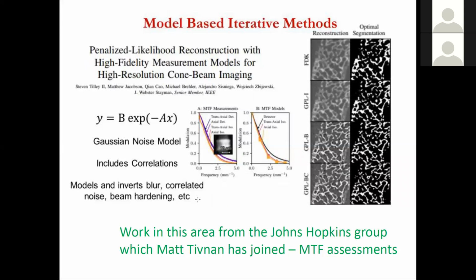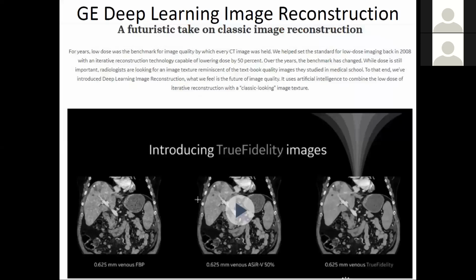But when you do that, you want to be careful what you're doing to your spatial resolution and your modulation transfer function. So there has been a whole lot of development of very sophisticated mathematical methods, which are, as I say, the ultimate in handcrafting. And then along comes machine learning. What do machine learning and artificial intelligence do to it? Well, it holds out the prospect that in the far future, you could just have your CT scanner learn its reconstruction algorithm and not have to code anything. We'll come back to that issue in a moment. But for right now, you're a little ways away from that, and you're using your model.